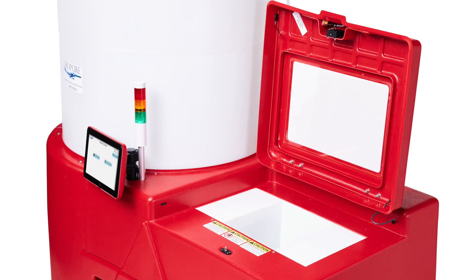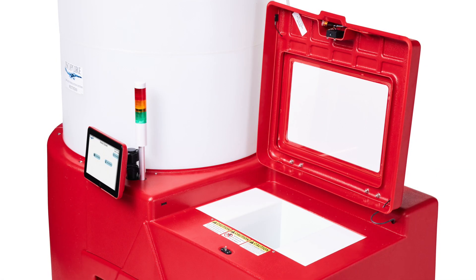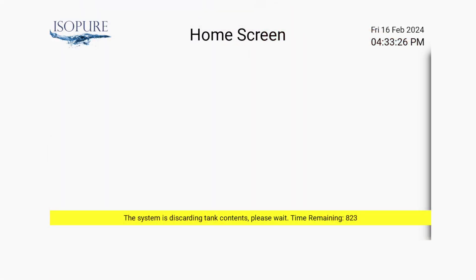If the batch is not transferred to the mixed tank within 14 days of mixing, the following error will be displayed. At this point, the tank must be drained and the batch discarded.